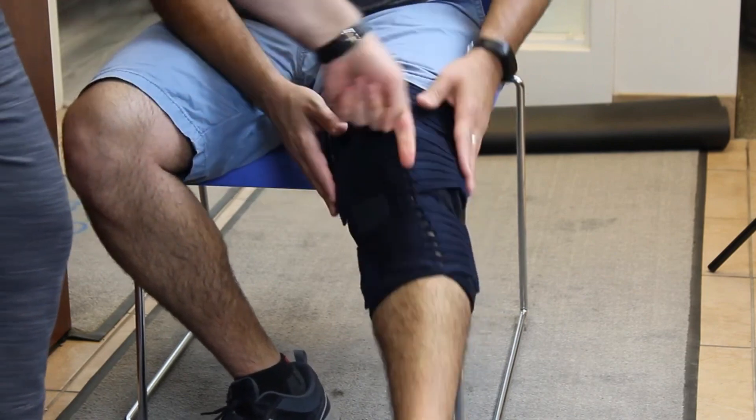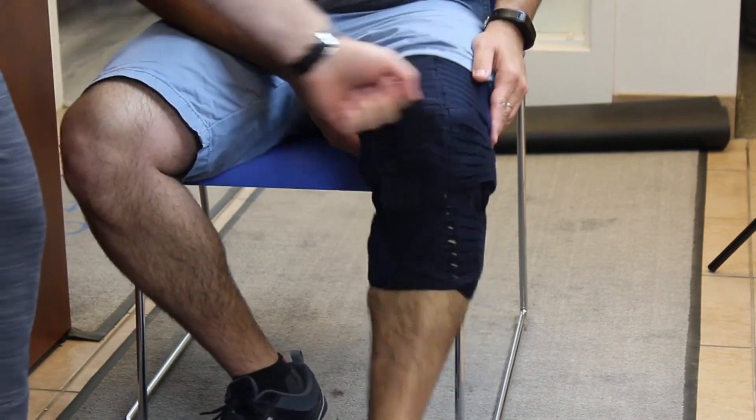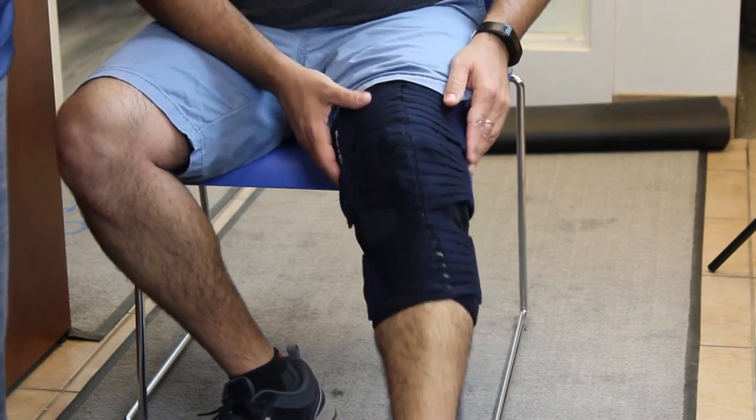As you can see, it doesn't block your range of movement — you can still move. You can play basketball or whatever you want to play, and you're supported for the ligament.